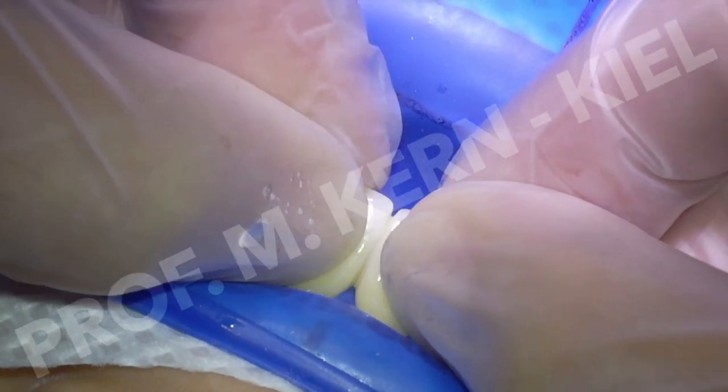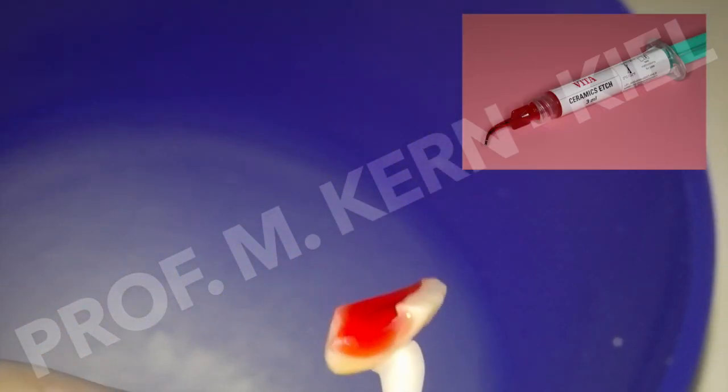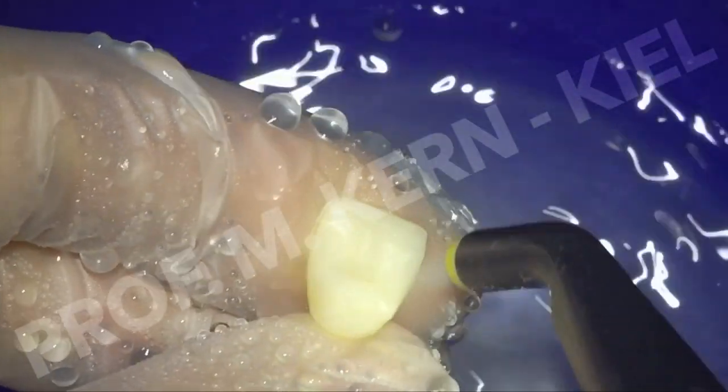After a try-in under rubber dam isolation, the bonding surfaces were specifically conditioned. The lithium disilicate ceramic was etched with hydrofluoric acid for 20 seconds, followed by thorough rinsing and drying.